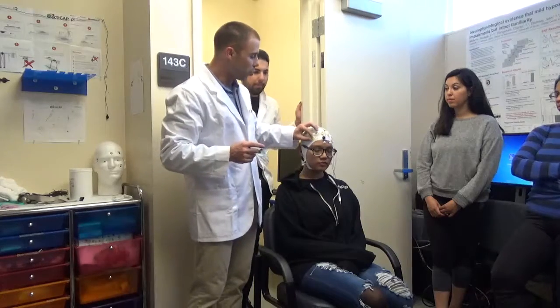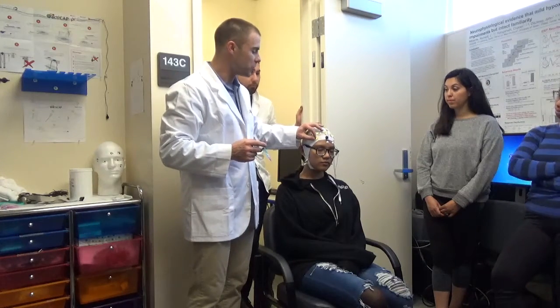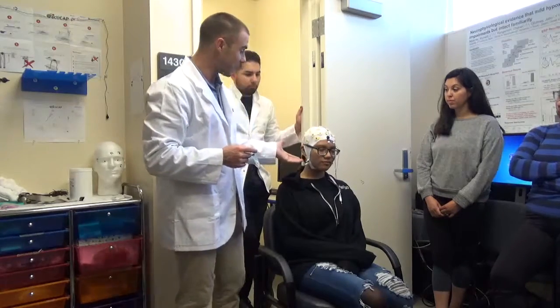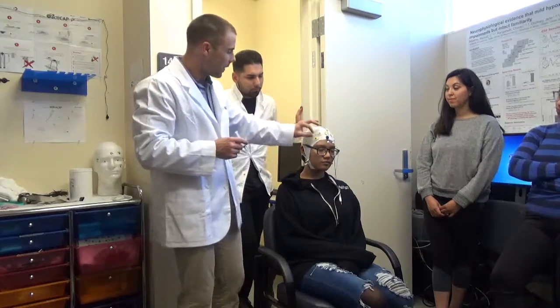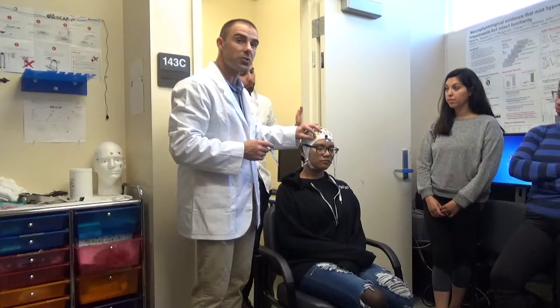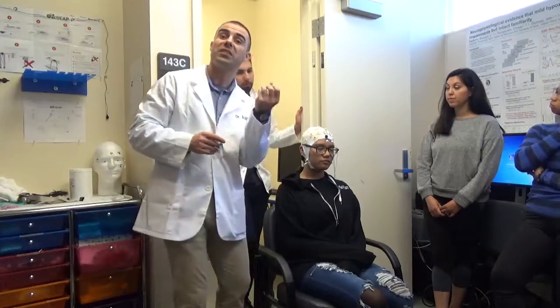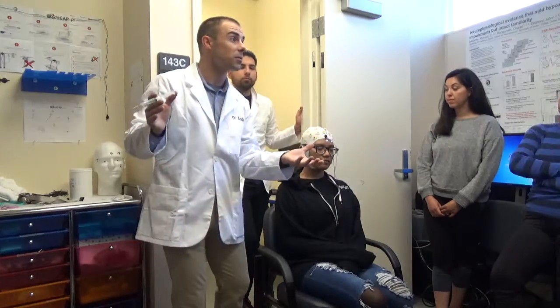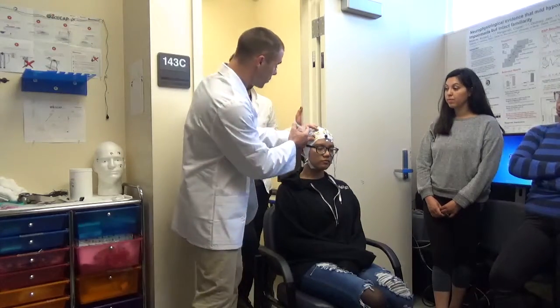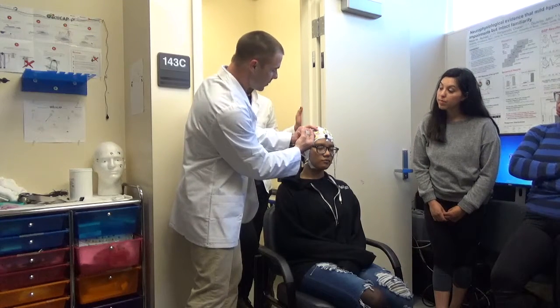So, one hand holds the capsule. Now, you don't want to jam it into her head because she'll react like that. She'll be like, ugh, right? You don't want to totally push her head away, but you do want to hold a little bit of pressure on it and hold it down to make sure the gel doesn't leak out the sides and create that salt bridge. Okay?